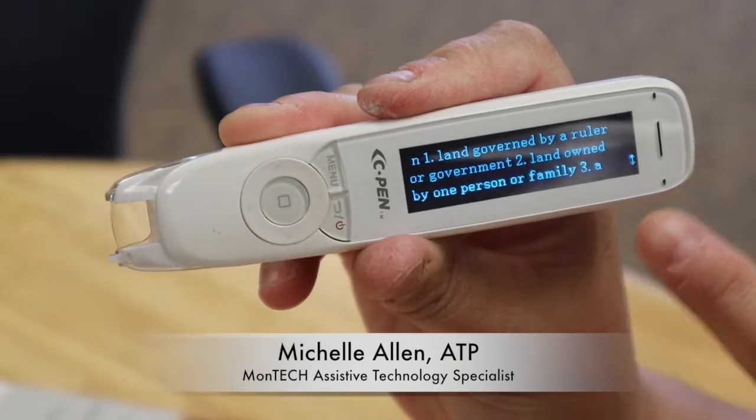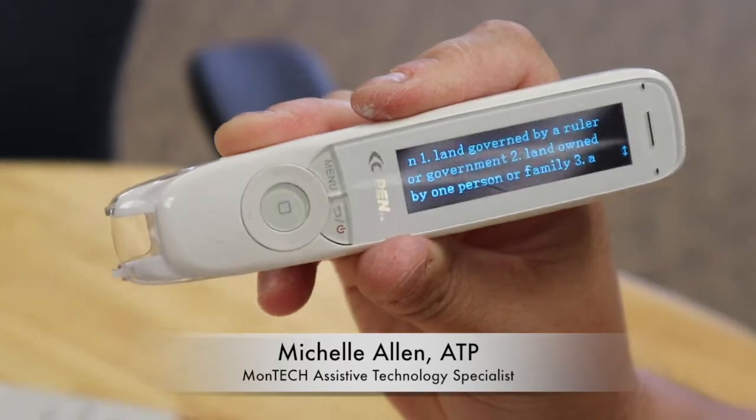You can also adjust a setting in here where you can have the definition read to you instead of having to read it yourself.